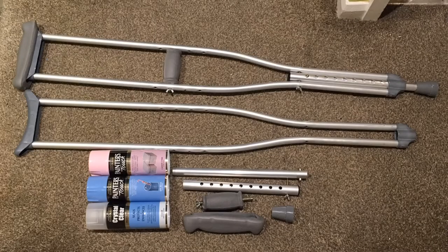Here you can see the top crutch is still intact, whereas the bottom crutch has been dismantled into its component parts. You can also see the three cans of spray paint — two of the colours that I wanted to use, and the third is a clear protective sealant in gloss.